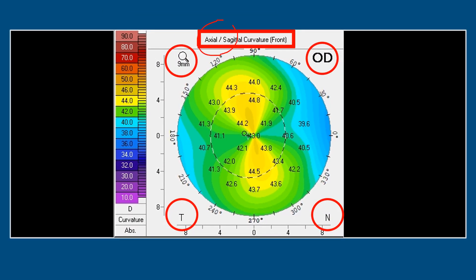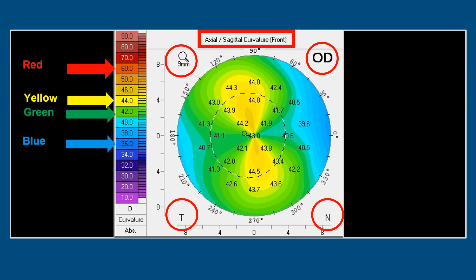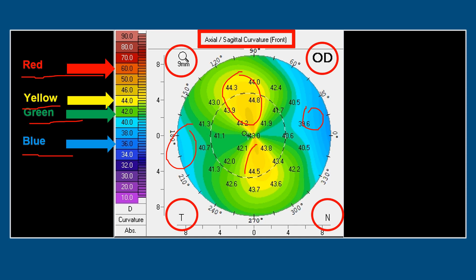This is the axial or sagittal map — also called the SAP map, S for sagittal and A for axial. OD means it's the right eye; the nasal side is here, the temporal side is here, and we have taken a 9 mm view. Red is the hot color, yellow is up to 44 diopters, green is around 42 diopters, and blue is around 36 diopters. That is how the values are represented in colors.